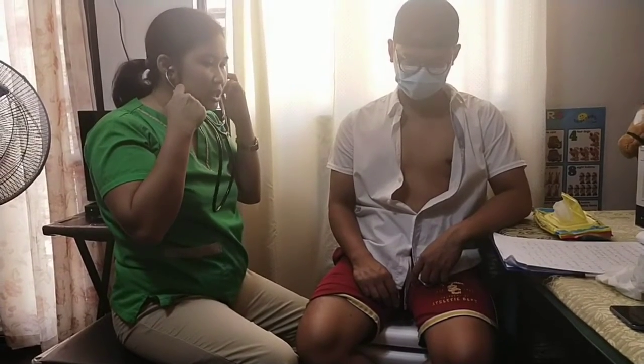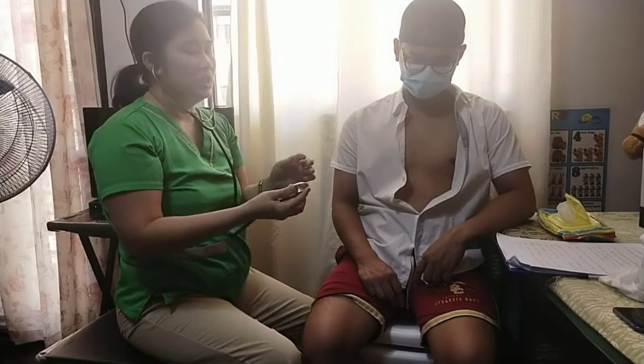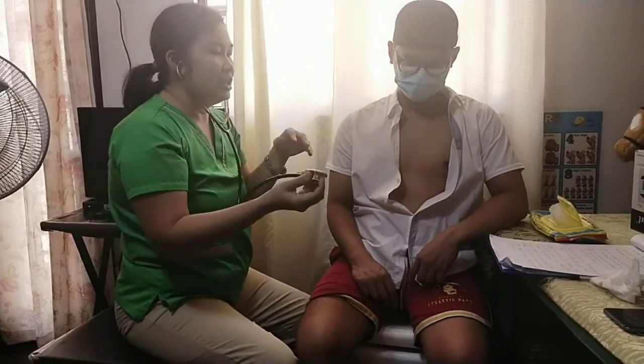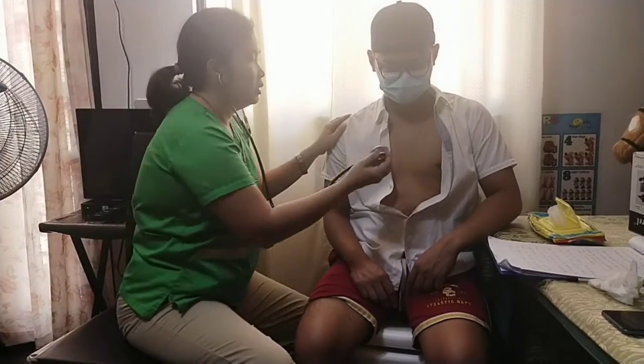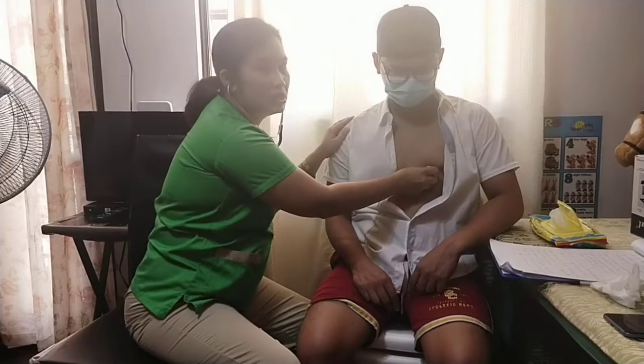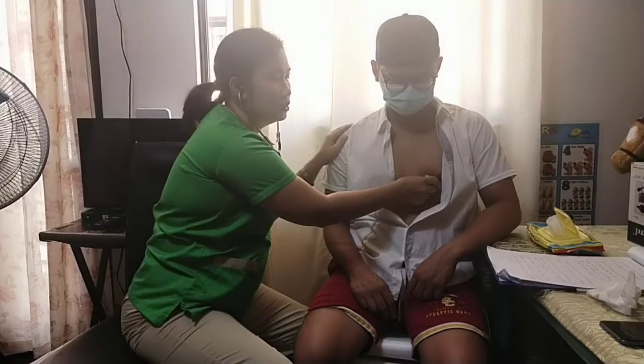Insert the earpieces of the stethoscope into your ears, angled slightly forward to facilitate hearing. Tap your finger slightly on the diaphragm to ensure this is the active side of the head, and place the diaphragm of the stethoscope on the apical pulse and listen to the normal S1 and S2 heart sounds.